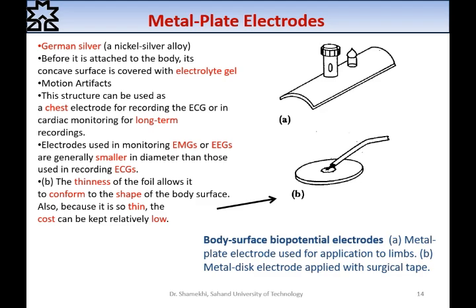The first electrode we want to consider is metal plate electrodes.